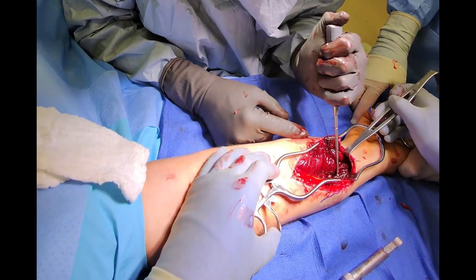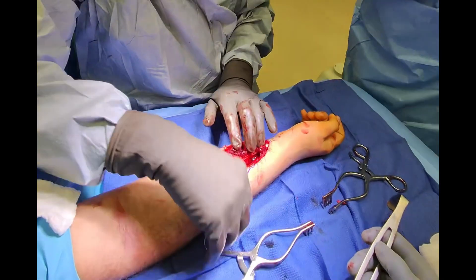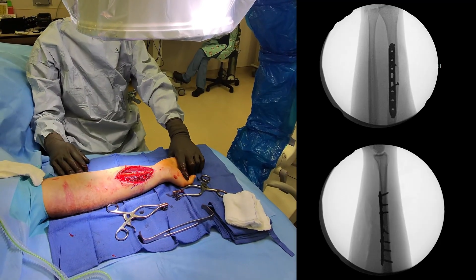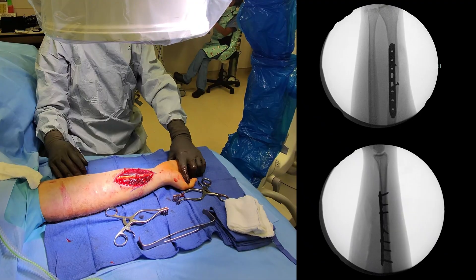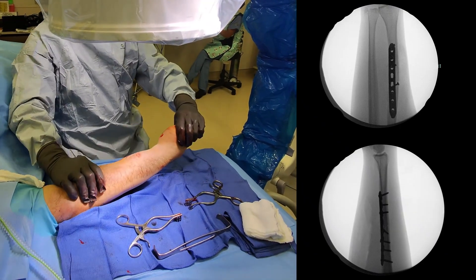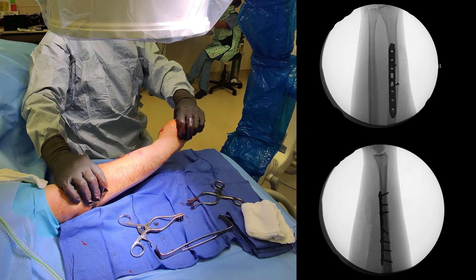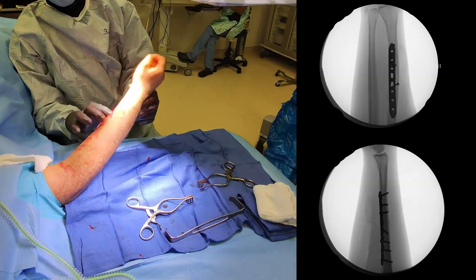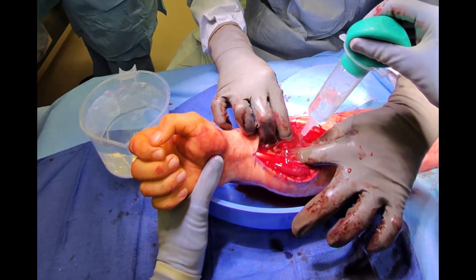Once all hardware is implanted, we use the C-arm again to verify proper alignment of the radius fracture. If the fixation and alignment is adequate, we use a sterile saline solution to wash out debris to reduce risks of infection.